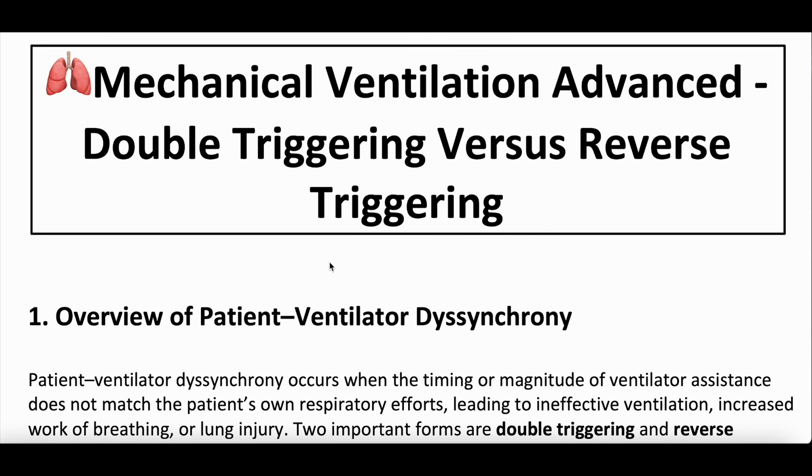So this is part of our mechanical ventilation kind of advanced series on ventilator desynchrony. And we're going to dive into these two different types of ventilator desynchrony. They can be very tricky to tease out which is which, but we're going to give you some ways in which you can do it. And once you do, the management of them is quite different, which is why it's so important.